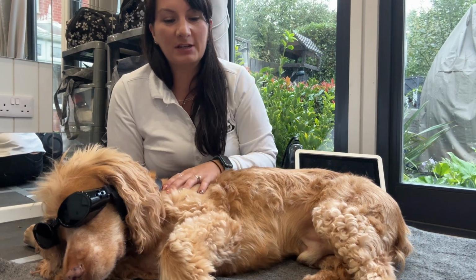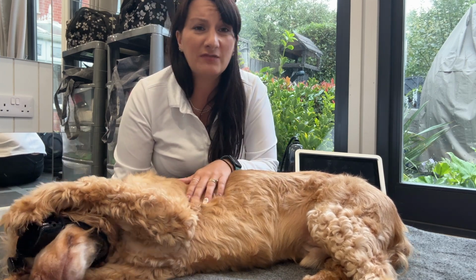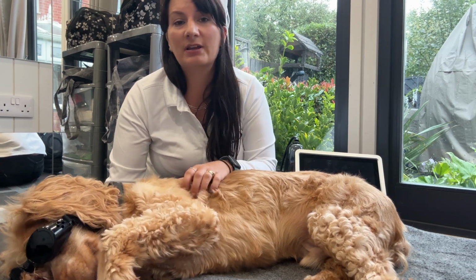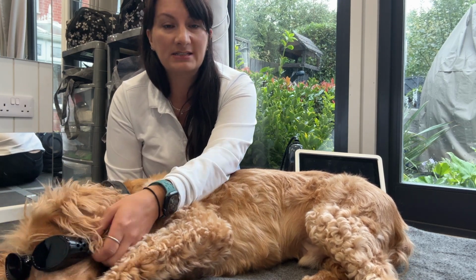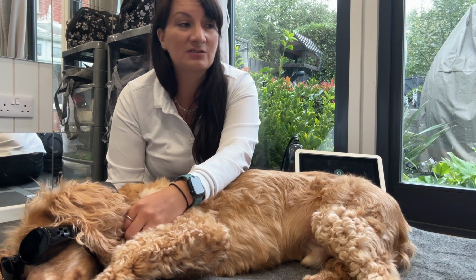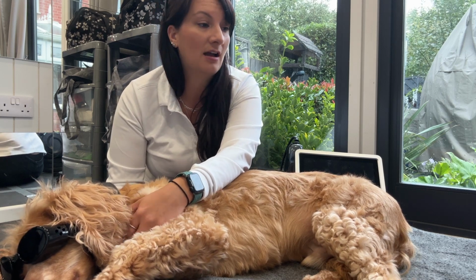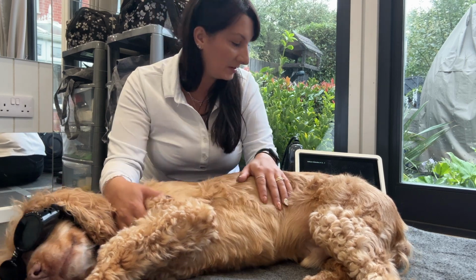We've got all these things that we need to think about as well. Some devices will obviously take that into account for you, but it's just being aware of why we need to take it all into account, because it's all going to affect the dose, the wavelengths that we use, all the things that we need to have a successful treatment.